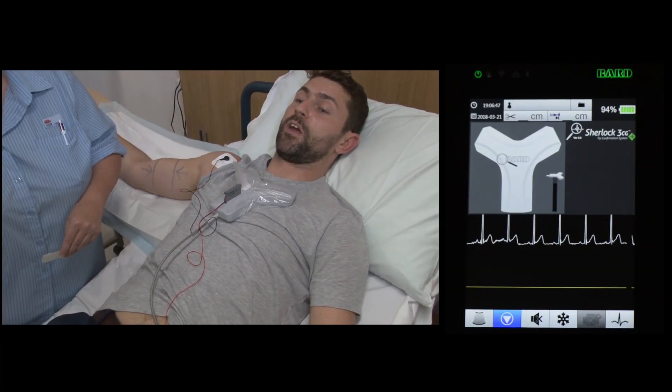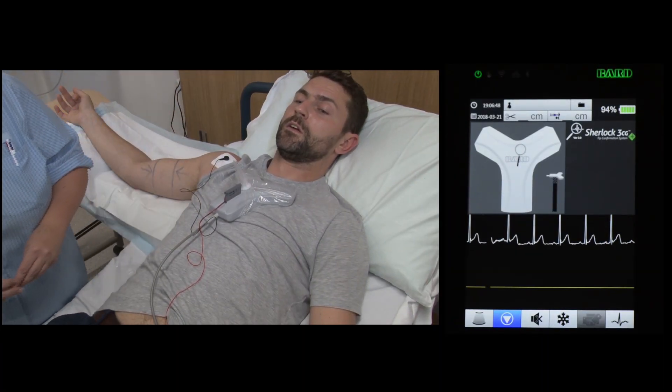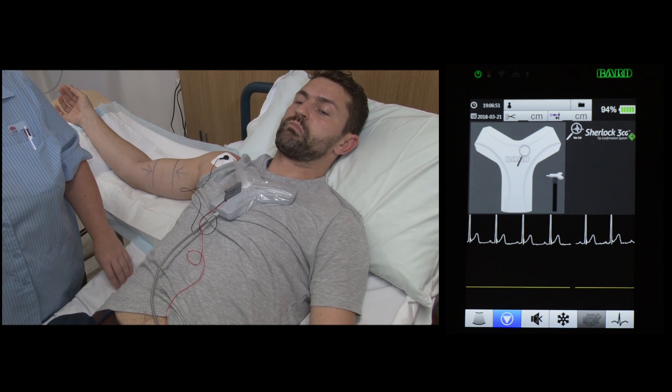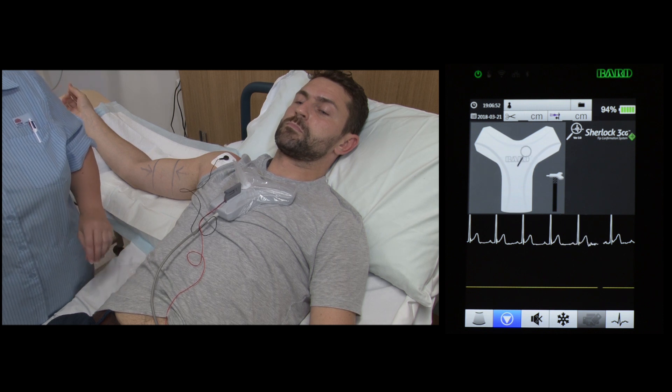Connection of the ECG leads to the chest plate allows for communication with the monitor.